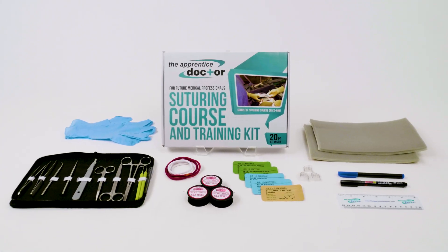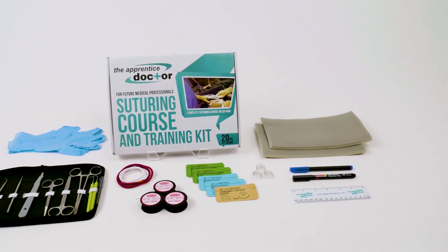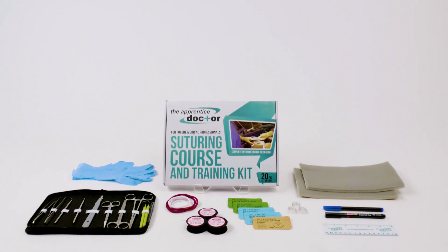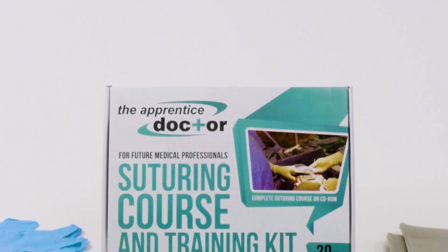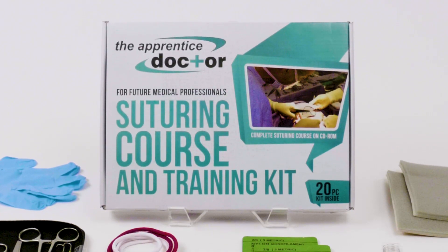the suture kit and course give you everything you need to become a suturing pro. Stitching up wounds with precision and confidence enables you to calmly engage patients who are anxious about their injuries. Begin mastering your technique today.